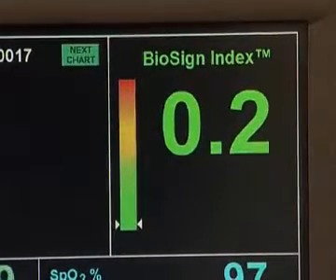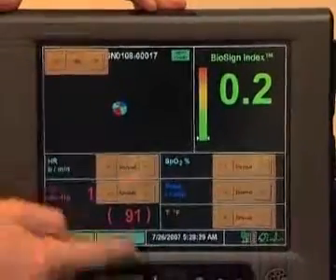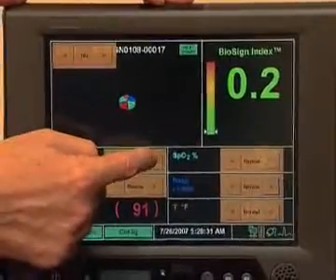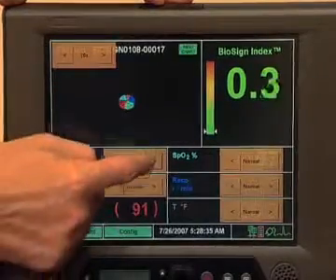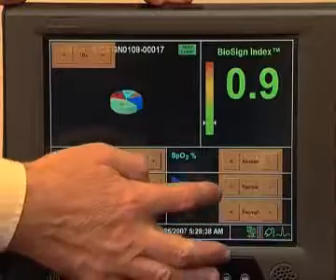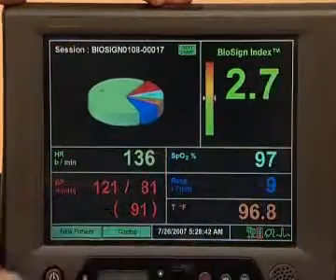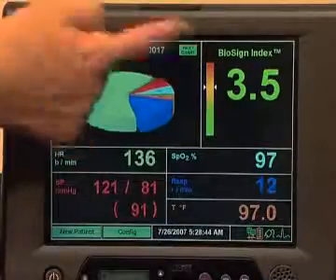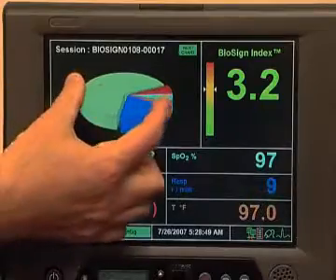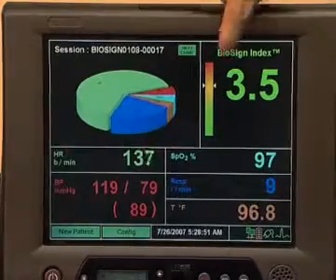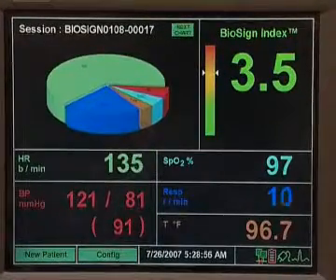I can demonstrate that by actually changing these values. Let's imagine that the patient starts having a high heart rate — if I increase this to go high — and at the same time their breathing rate drops low. You can see already that the number has grown. The pie chart representing the vital signs has also got much bigger, and the number has gone above 3, which is the threshold for alerting.